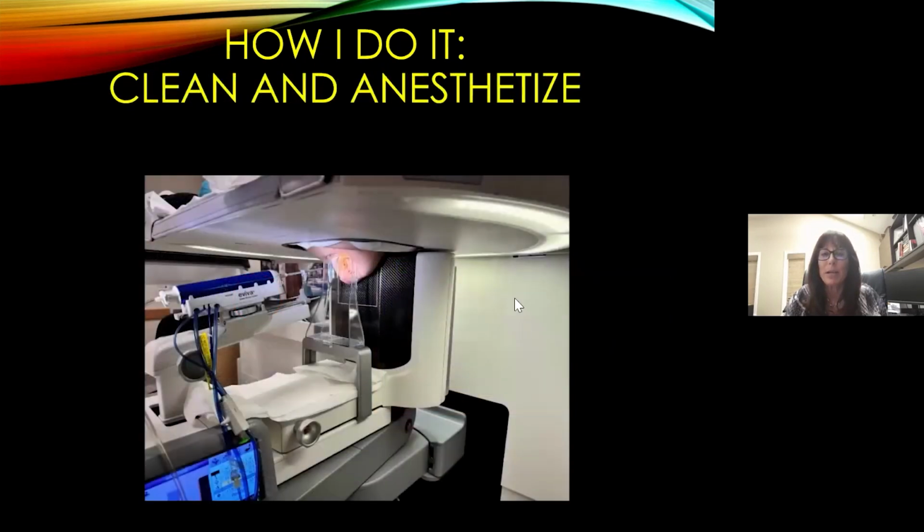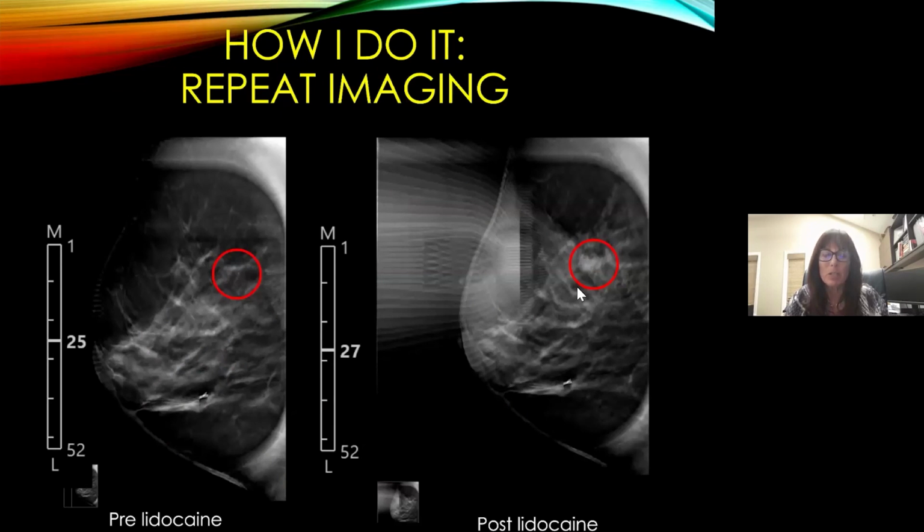We then clean the breast and proceed with local anesthetic. We use 1% buffered lidocaine for a skin wheel and lidocaine 1% with epinephrine for deeper anesthesia. I usually re-image following lidocaine because sometimes the target can move after the lidocaine bolus. So in this case, here's the pre-lidocaine image showing a Z of 25, and following lidocaine, there's a 2 millimeter difference. Not significant, but sometimes they can actually move a little bit more than 2 millimeters. And they can move not only in the Z plane, but the X and the Y as well. So we may need to retarget.